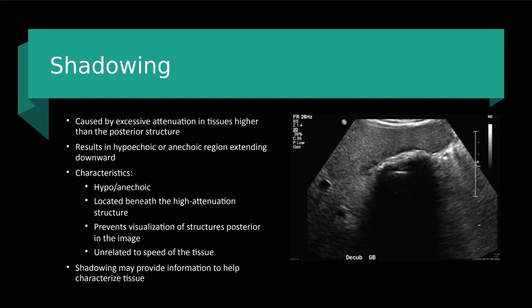Shadowing, this has to do with attenuation of the tissue, right? So how much of that sound beam is being absorbed. And then shadowing may provide information to help characterize that tissue. So this is going to help us aid in that diagnosis.